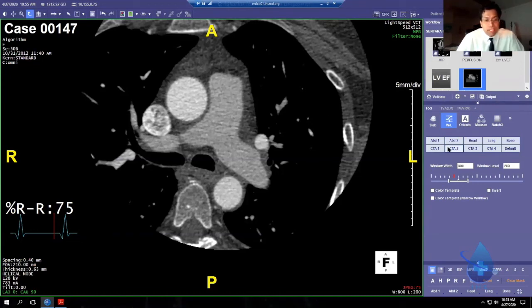So if we read Nuclear Donuts in black and white this week, there won't be anybody with ischemia. If we read them in color settings, or change the standard deviation setting to 1.5 SDs on our nuclear workstation instead of 3.5 SDs, then everybody will have ischemia, and we'll send everybody to the cath lab and they'll all be normal.